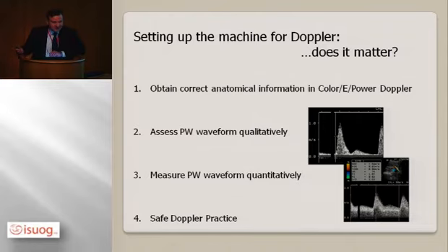So a raised PI in one unit using one machine in a certain way may not be the same as that somewhere else.